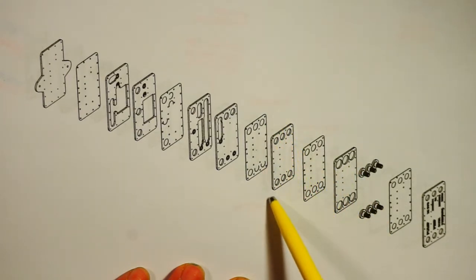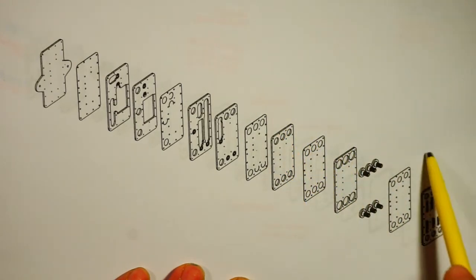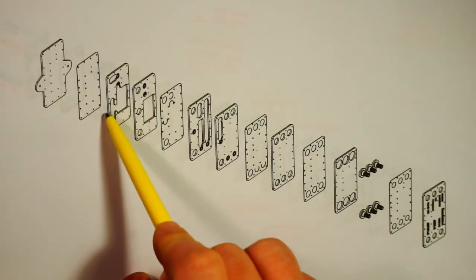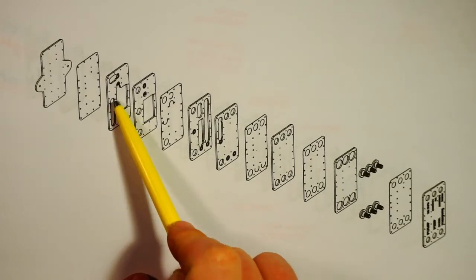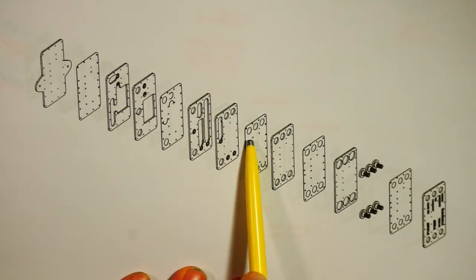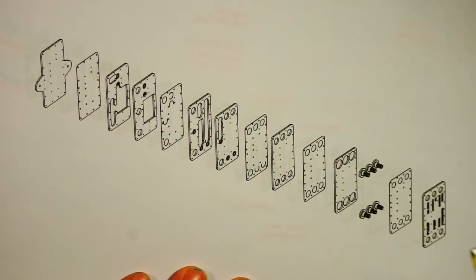And so for all practical purposes, these are not part of the valve system, and so we can kind of ignore them. Likewise, this is a seal and this is a backing plate, and these don't have really anything to do with the function of the valve other than sealing the block. So really where the action happens is this plate, this membrane, this plate, and this membrane. So we're going to look at this valve block assembly in different cycles and see how the flow and pressures pass through this valve block during the function of the machine.